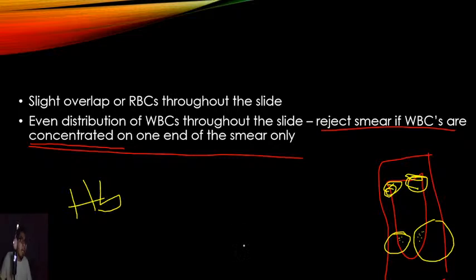Okay? I've seen some of my interns do this several times because they're used to making a smear. All right? And they can make a smear with a feathery edge, but they just think that the blood is not enough, so they add an extra drop on the end. So avoid doing that one.